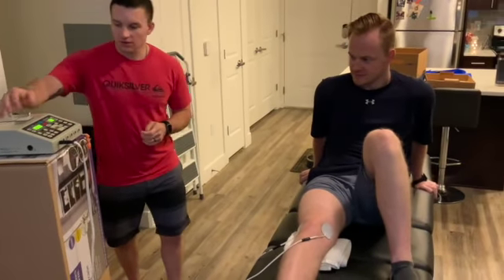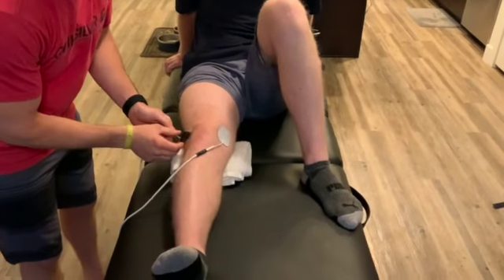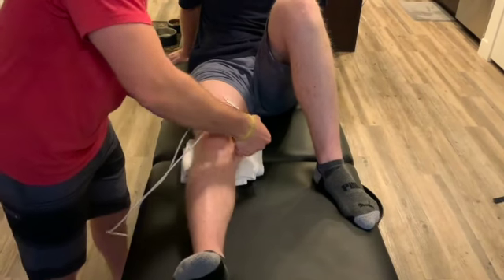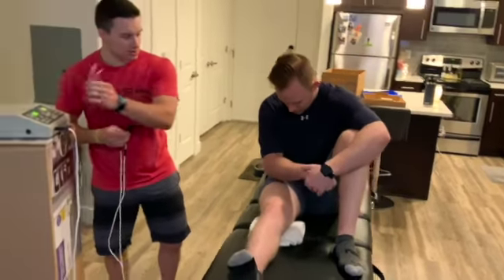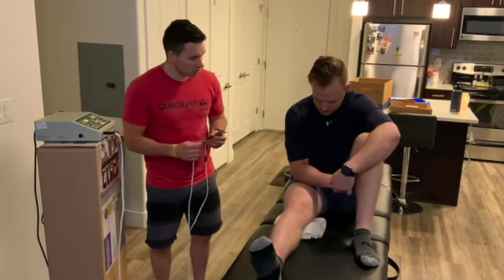Okay, perfect. And then I'll stop this for you, and I'll take these off. Sorry, I might pull on your leg hairs a tiny bit. You're good. Perfect. Doesn't seem like the pad's burned you or anything, which never happens, but it's always something we just got to make sure. Okay. Sensation feeling okay on your knee? Hurt or anything like that?